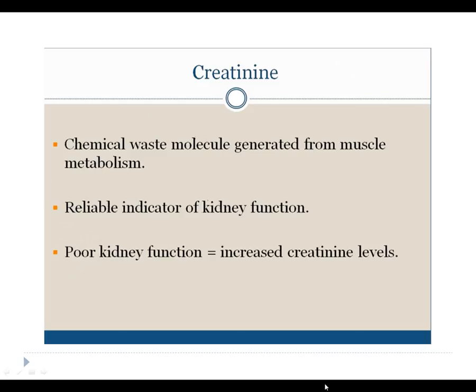Normal creatinine levels are between 0.8 and 1.6. These levels may be different depending on the laboratory or MRI facility departmental protocols. Along with the creatinine level, several factors can affect a patient's GFR. The GFR will decrease with increased age. Men usually have more muscle mass than women, and the GFR calculation is adjusted for this. African Americans also tend to have more muscle mass than other ethnicities, and the calculation is also adjusted.